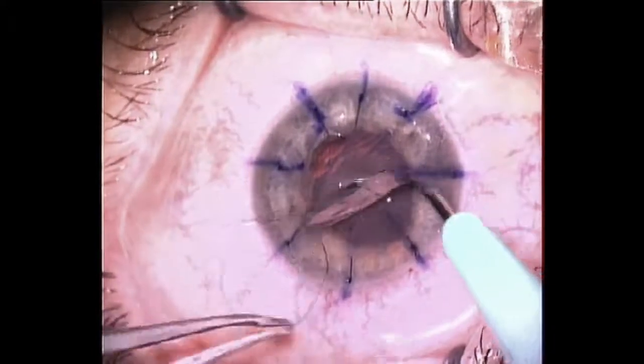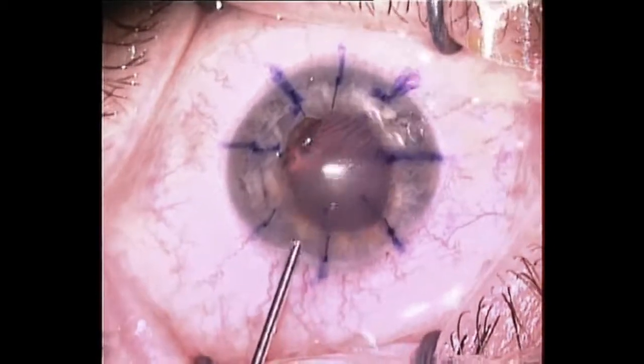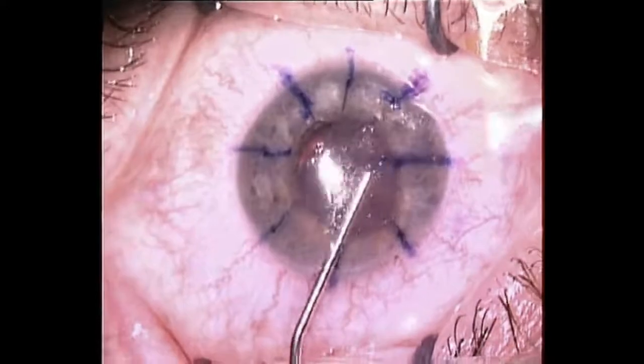As you see, the knots are not buried inside the stroma, but rather left outside, which obviously needs to be covered with a contact lens.